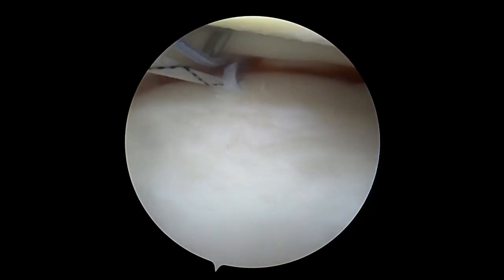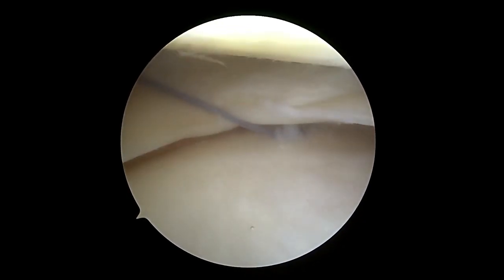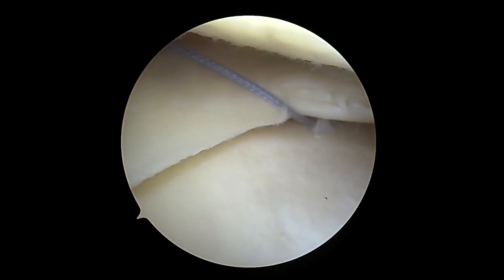The repair stitch from the tibial anchor is then fed through the knotless mechanism in the anchor using the black and white shuttling suture and provisionally tightened. We recommend placing one to two of these anchors in this fashion at the mid portion of the MCL and a second one just posterior to the MCL.